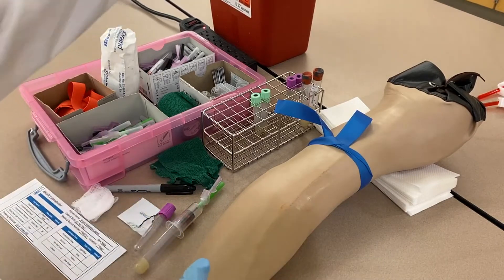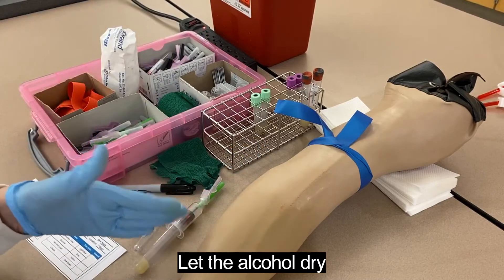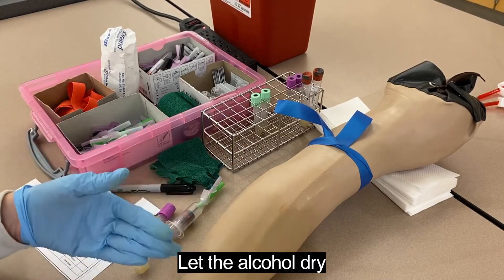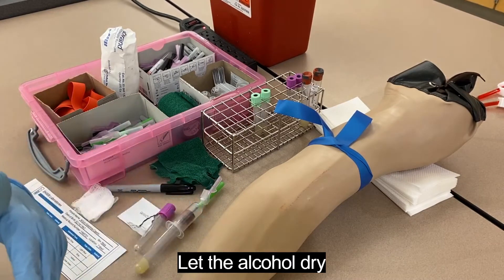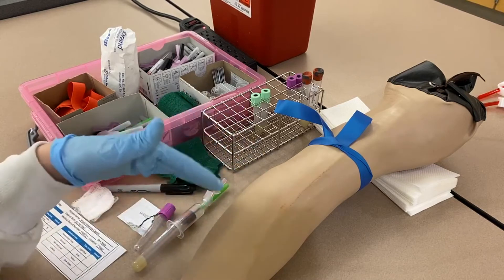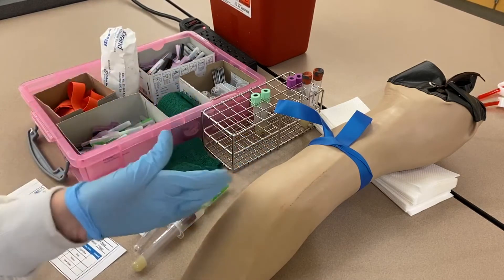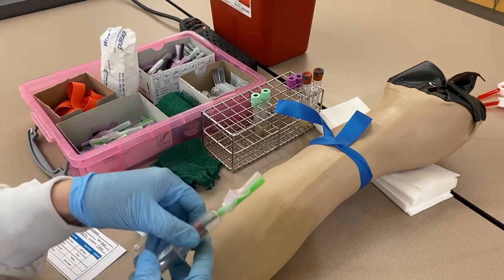Let the alcohol dry before sticking the needle in. If there's alcohol on the arm, it will sting the patient and can also cause hemolysis of the sample. Don't blow on it and don't touch it again after this point. Once I've palpated for the vein and started washing with alcohol, I keep my eyes on the site where I'm going to be sticking so I don't lose it — especially if there aren't good visual landmarks.